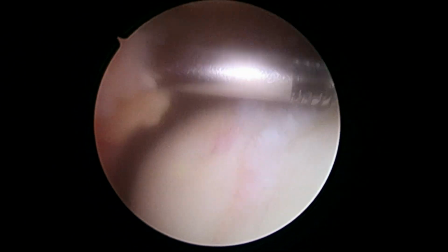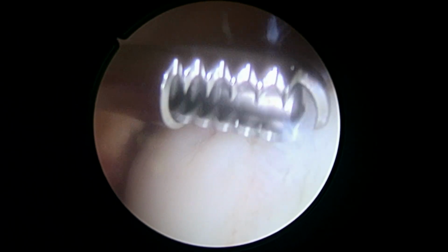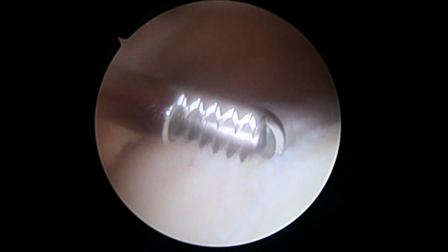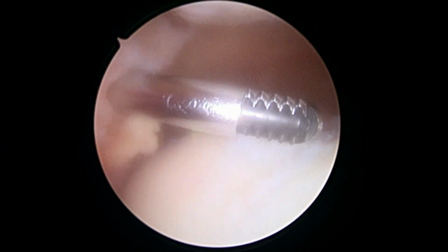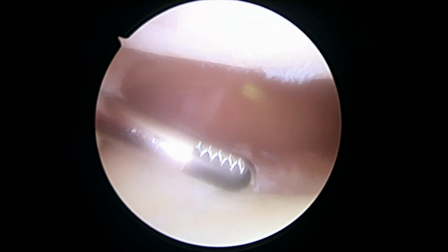Okay, so this is the patella at the top of the screen. It is actually in pretty good shape. The trochlea has a little bit of roughness to it, see right in here? But I don't think we have to do much for that. That's often an appearance that we are able to successfully treat with an office-based injection and not surgery. So I think this will be okay.